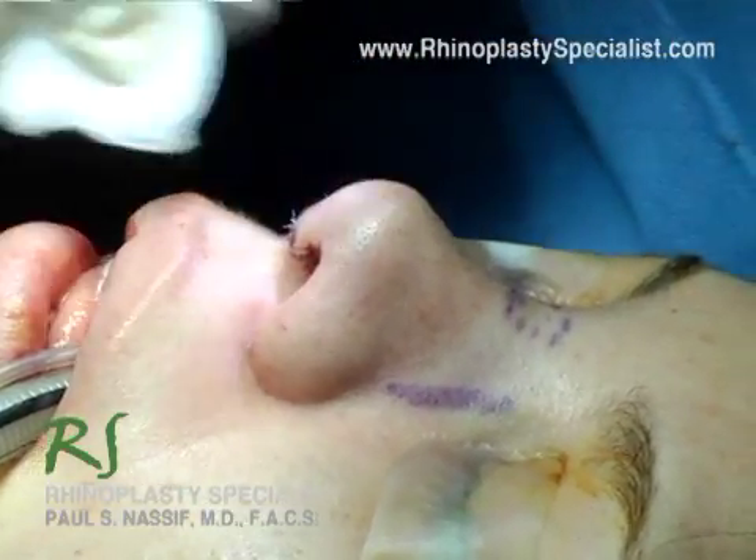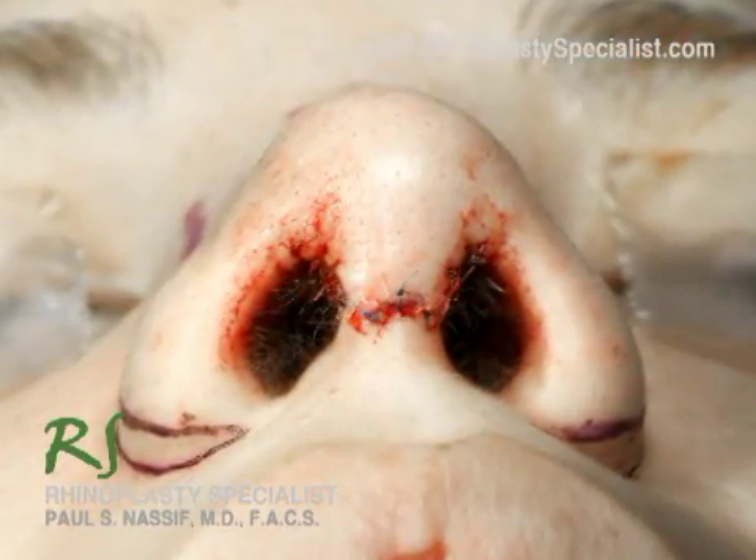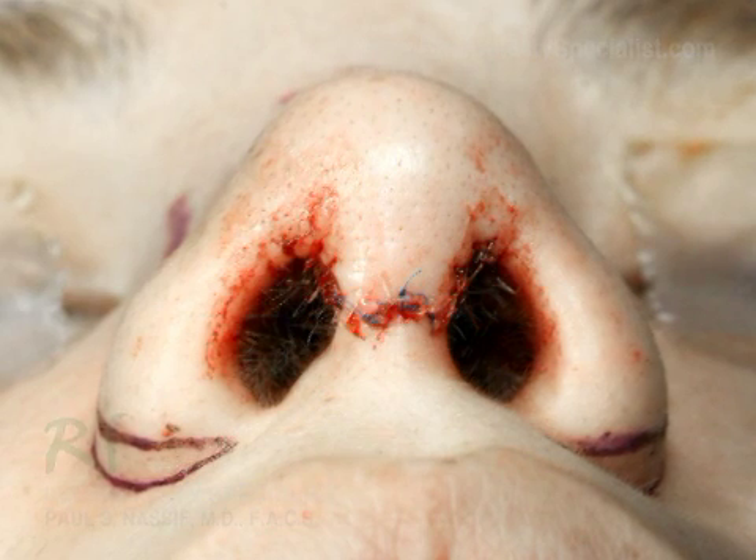We've just finished the formal rhinoplasty and closed our incisions — those look fantastic — and then we just have to finish up with making the nostrils smaller.